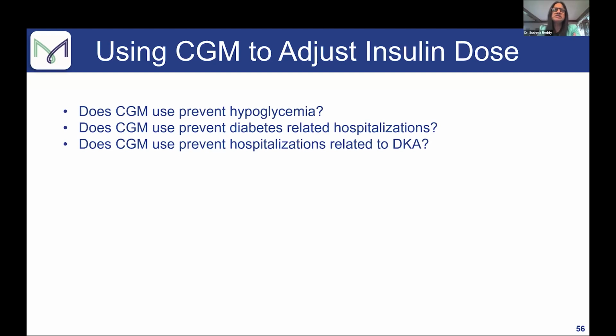Absolutely. So one is using Skin Tech. Skin Tech is a sticky glue kind of thing that comes as a wipe. You can order it on Amazon. You can just put it around the area where you're going to put the sensor and then put the sensor on. The second way is to put overtape. Both Dexcom and Libre have overtape that you can tape over it, but don't tape over the actual hole where the sensor is, just around it. So those would be the two methods that are easy.